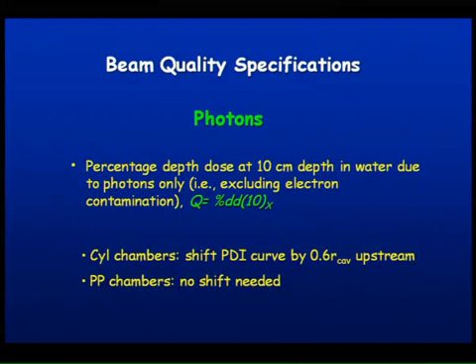So we need to know all these values of all these parameters as a function of depth so that we can calculate the dose at different depths divided by dose at D max, then we get percentage depth dose. And Jan has shown us how some of the recent calculation shows how P central electrode and P wall changes as a function of depth. So the protocol assumed that almost all of these factors as a function of depth is negligible.